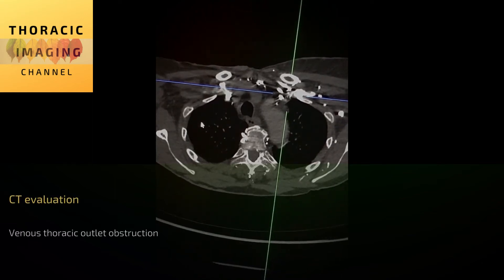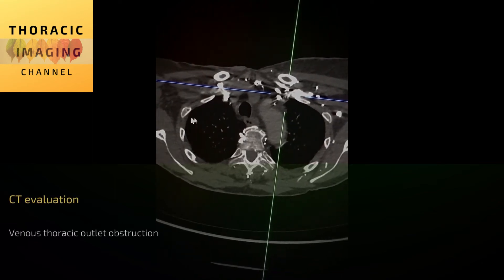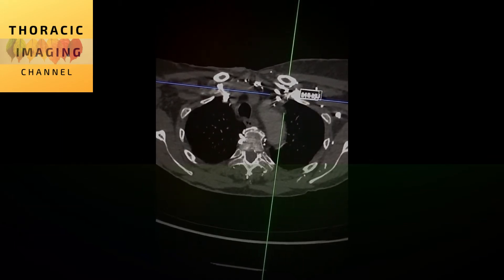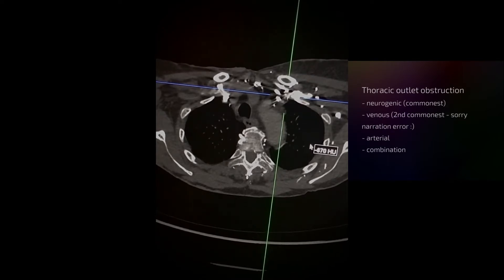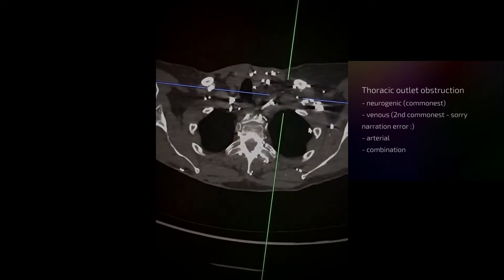In this video we're going to look at some of the CT features of venous thoracic outlet obstruction, which is considered the commonest form of thoracic outlet obstruction with the others being arterial and neurogenic.